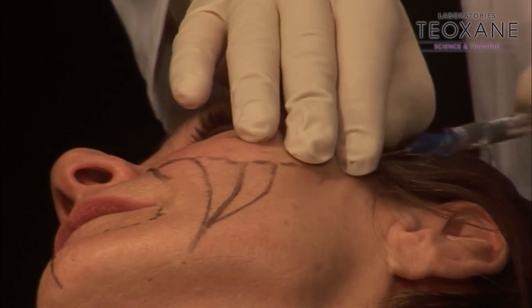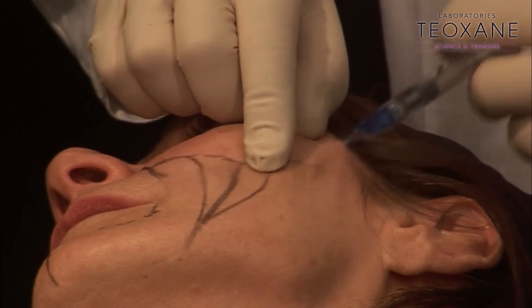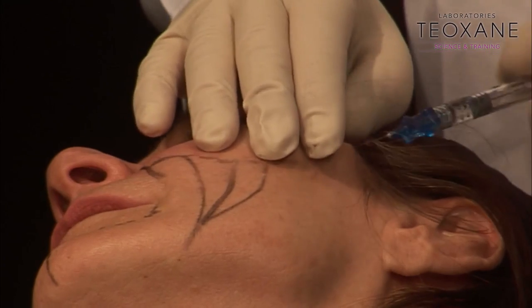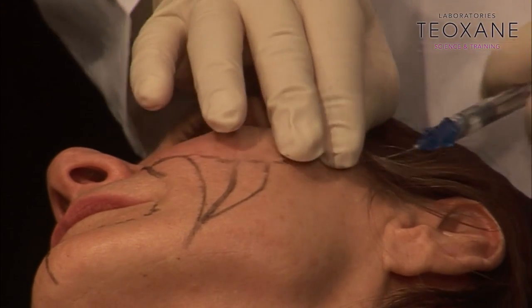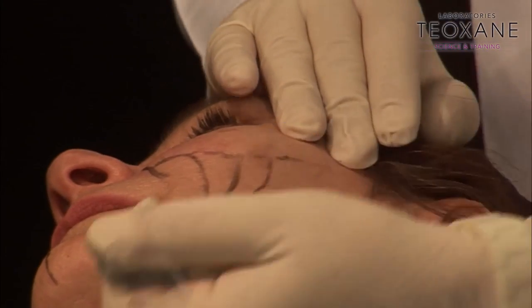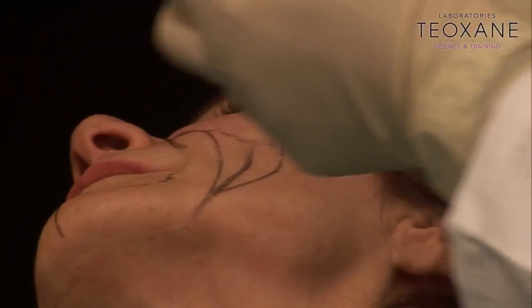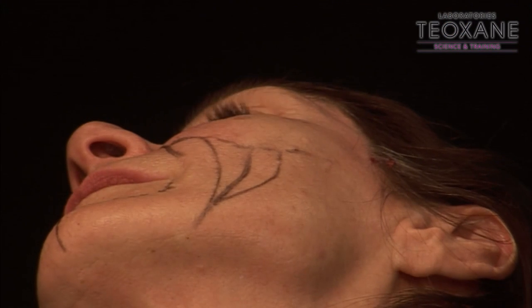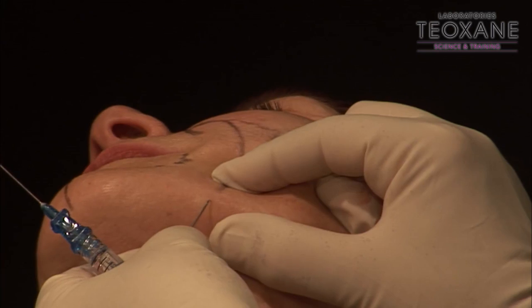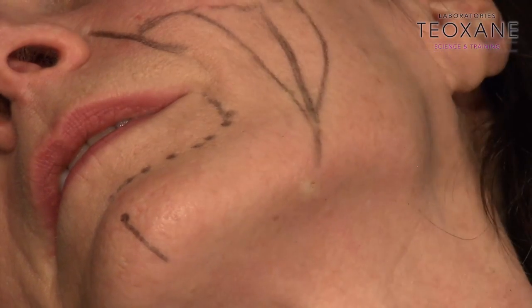Now, I could carry on and do the filler in the lower cheek here, but you see, I'm quite limited. And I don't have the right axis. So I'd rather change. Prepare some more, please. I'd rather change and use a more vertical approach from underneath, which will allow me to join the other area. I prepare the same thing, a little anesthetic dot here, you see. Simple, quite easy.